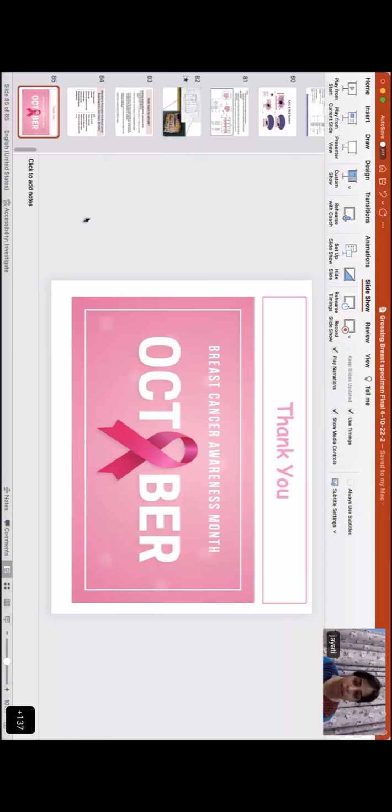There was one more question. In case of tumor in close proximity to skin or involving skin, with overlapping morphological features of skin and breast tumors, how to approach such lesions? What IHC should be done? I think that is a whole separate talk altogether. I think it is going to be covered in the malignant lesion evaluation in the subsequent talks. So I guess we should leave that for Dr. Chinoy or whoever is going to take that.